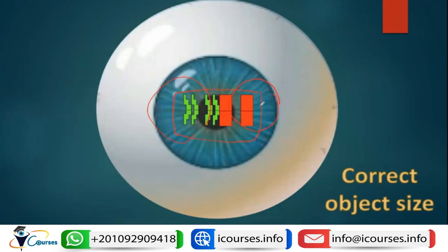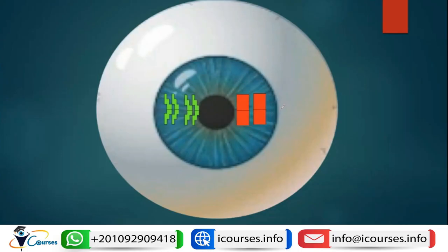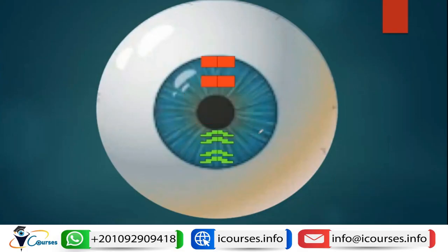So this will be the correct object size. But if the green staircase and the red square are far from each other, then we have too small an object size because they are far. If we move them a lot so that they enter each other and are separated like this, it means we are moving too far. So we now have too large an object size, and this will be incorrect.